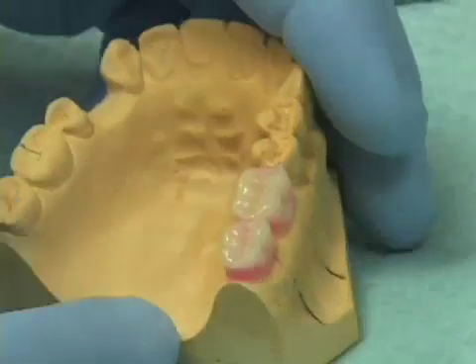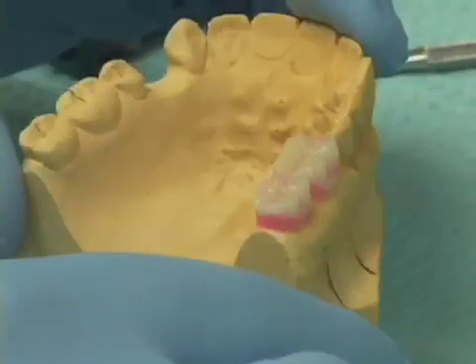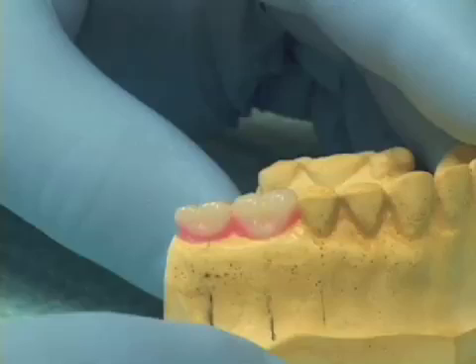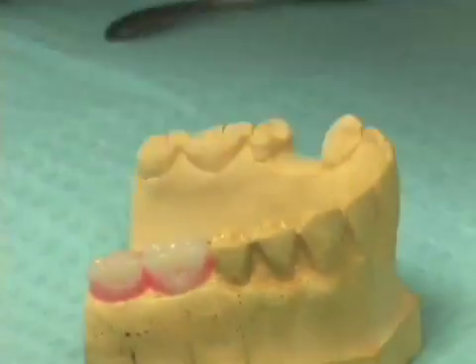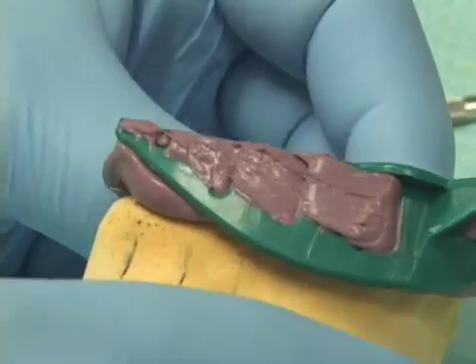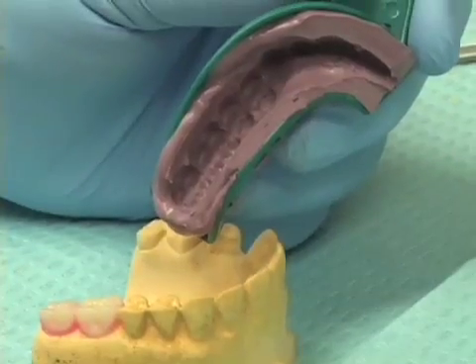If ahead of time we had a study model of our patient, one of the things we can do is when this model has had the diagnostic setup done on it, we can lubricate the model with some Vaseline or some triad model release agent, take a piece of gauze or a cotton roll and wipe away all the excess Vaseline, take a quadrant tray and simply take a PVS impression of our diagnostic setup. So this PVS impression is taken right on our study model, and if this is made ahead of time, it's quite a help.